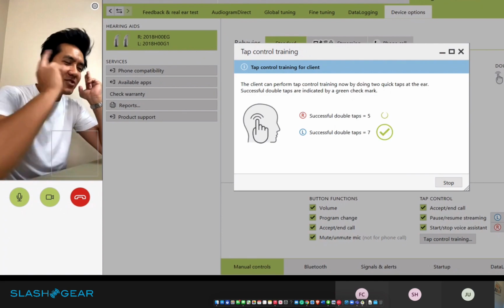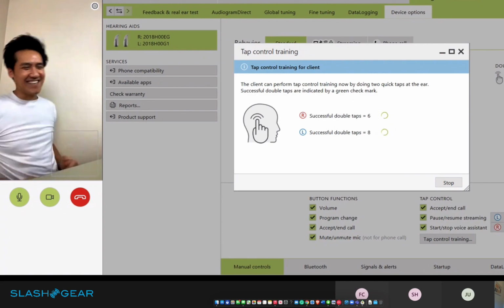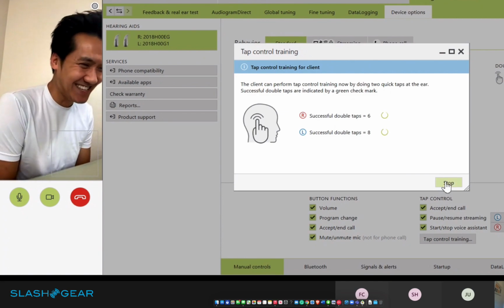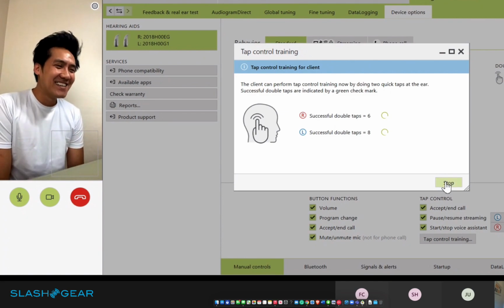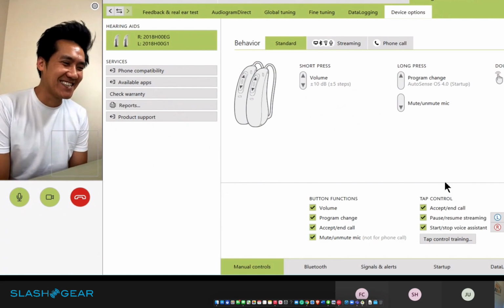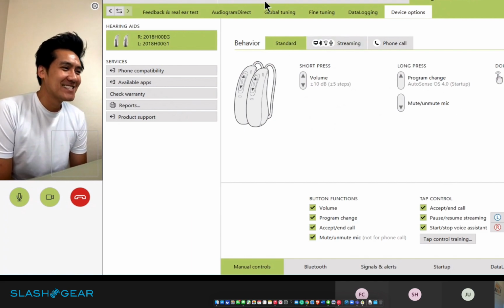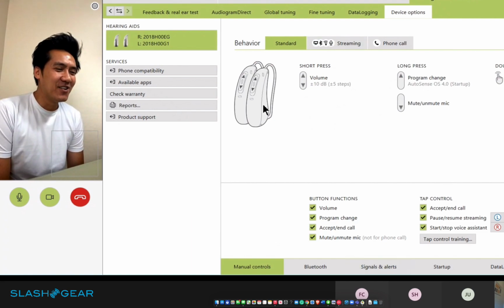But I could see this turn into a game. You're doing nicely. So you did very good. Okay, very good. I've had a lot of practice the last few days. I can see that. So that really covers most of it. Oh, that's fantastic. Thank you.